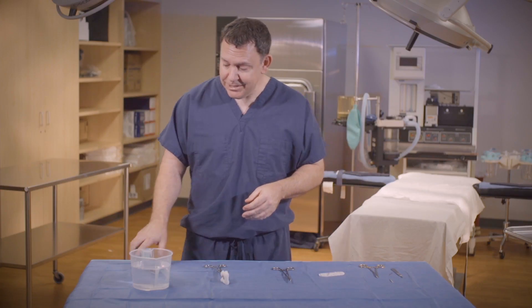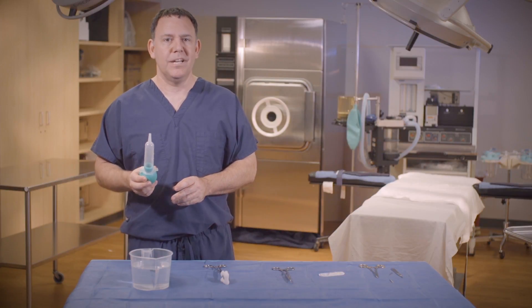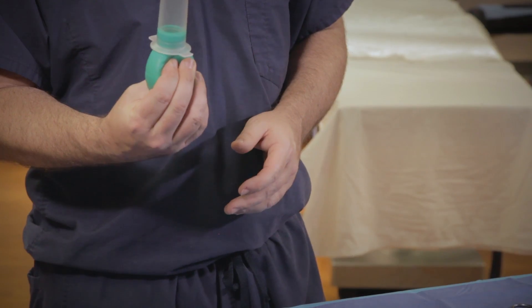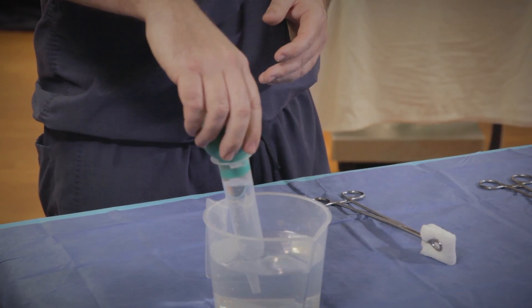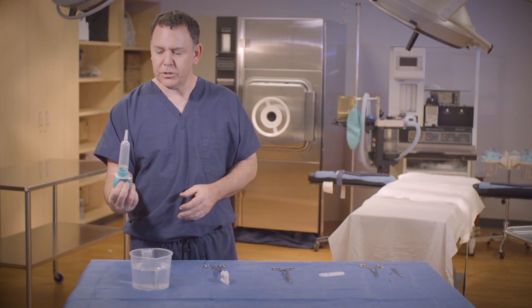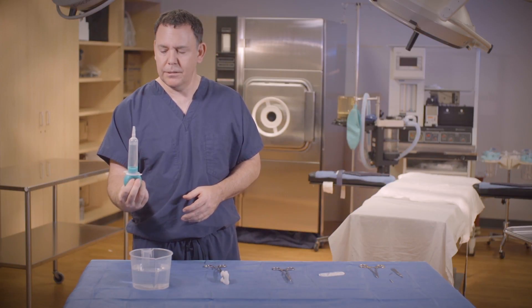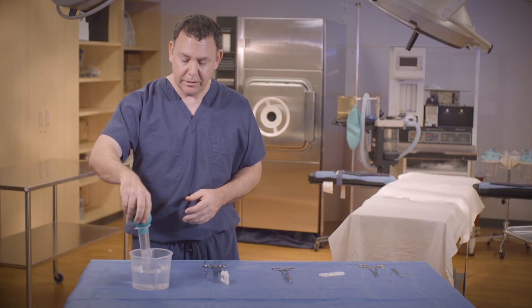Now our last second skill is filling up an Asepto. This is a skill we do every single day. So we have our saline in our pitcher. Simply squeeze the bulb, insert the tip into the saline, release, and lift. The key is not to splash all over your back table or all over your circulator. Unless you're a little passive aggressive and want to splash your circulator, then maybe that'll be okay. But here at Surge Tech Academy, we don't advocate splashing the back table or circulators.